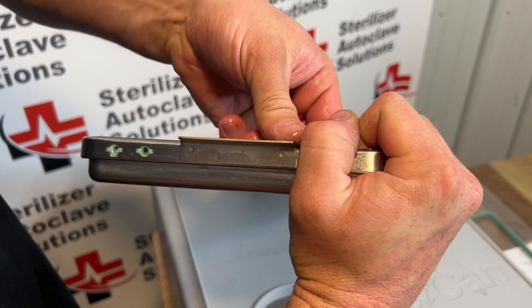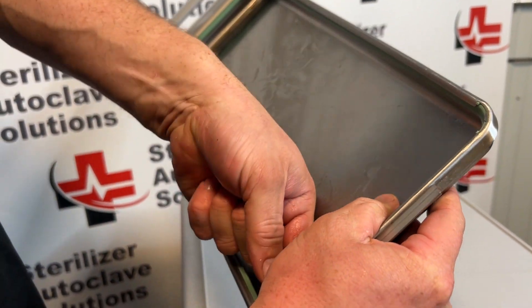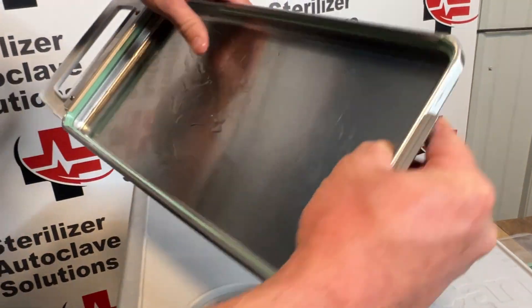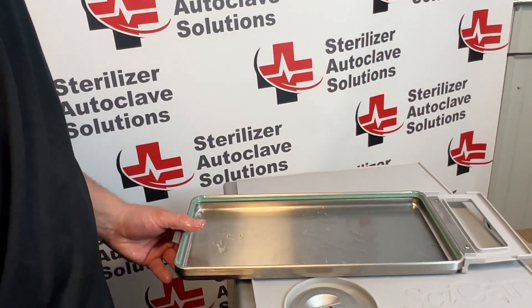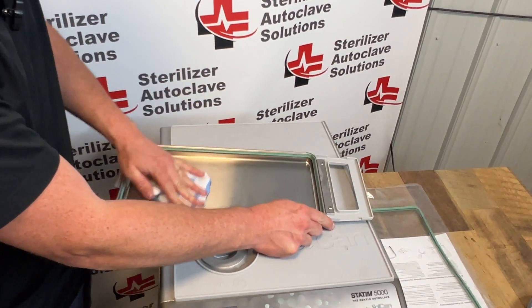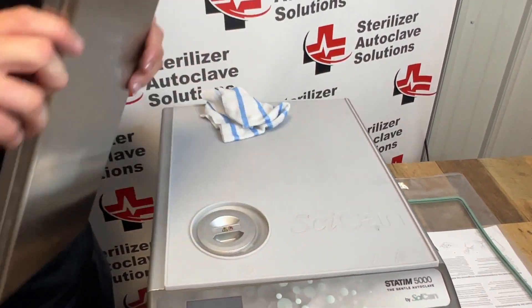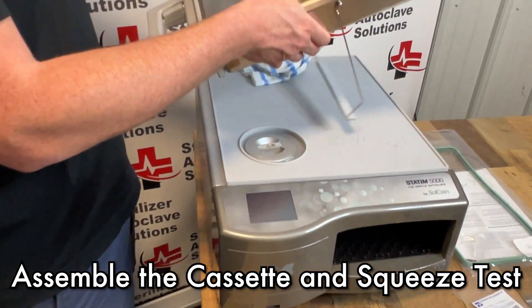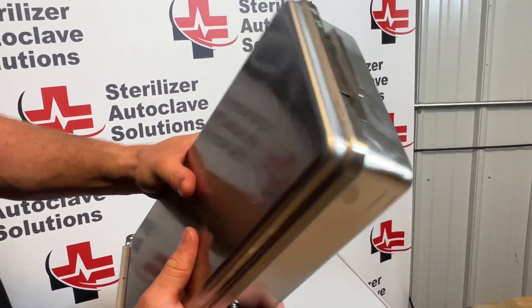That looks pretty good. We want to inspect the corners and make sure the nubs are in the corners. If you need to adjust, put your finger in the groove and slide. I'm going to wipe out this cassette — this will leave residual water on your lid. You can use stat dry to cut down on that oil. Put the top and base back together and give it a good squish test — squeeze it and make sure air is coming out the back.